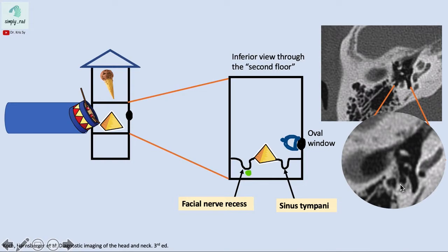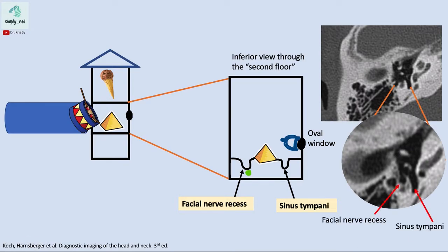Notice the facial nerve recess is adjacent to the mastoid segment of the facial nerve. The sinus tympani is important to examine because it is a clinical blind spot — cholesteatomas may frequently hide in this area. Always check the sinus tympani and report possible cholesteatomas hiding there.